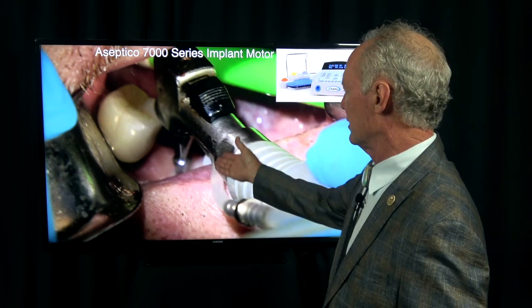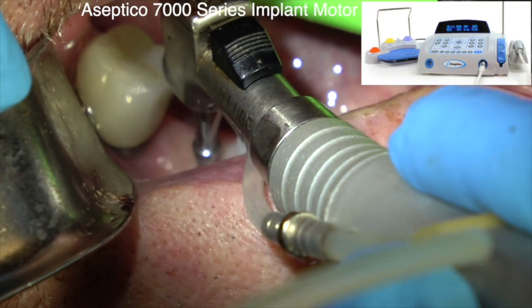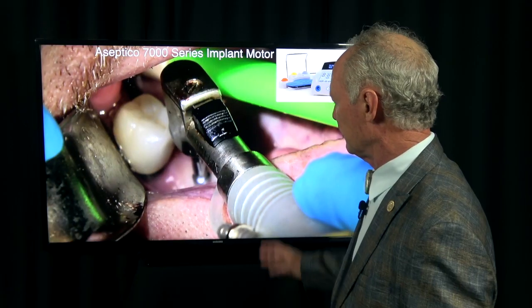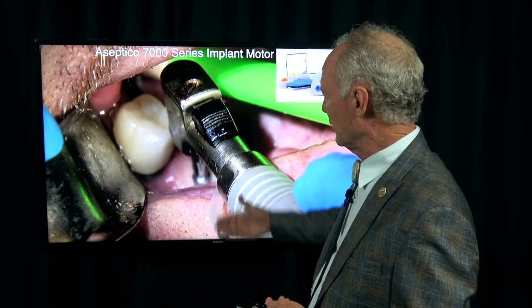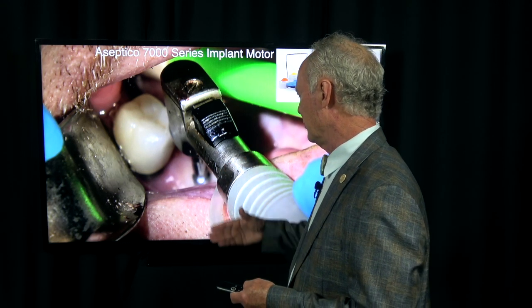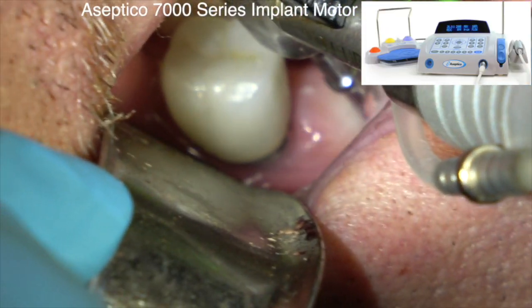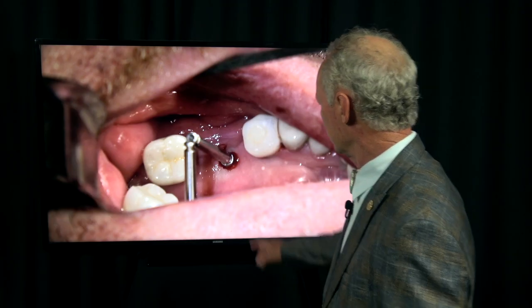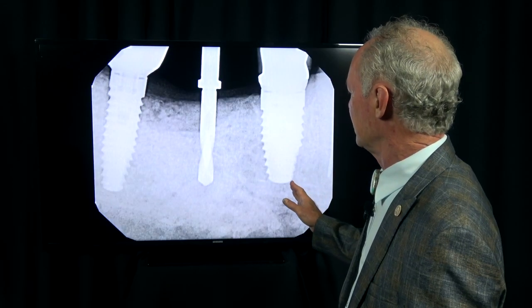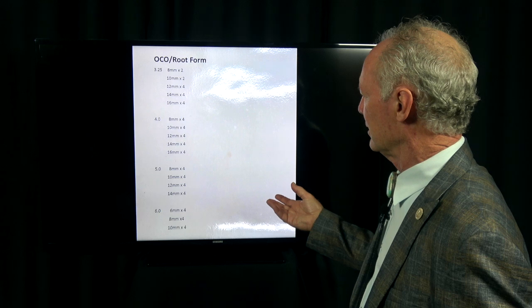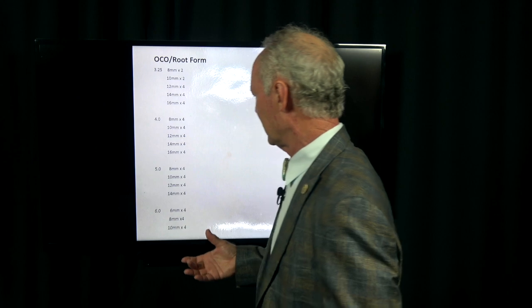If the bone is soft enough, you can start with the pilot drill with the shoulder on it, but I usually start with just a plain pilot drill. When placing the implant, you always want at least a millimeter of bone surrounding the implant. You don't want to be too deep, and you also don't want to be too far to the lingual because of the concavity on the lingual part of the mandible. I'm just slightly facial, but I've got plenty of bone on the facial — alignment is just right. I want as wide an implant as I can get without encroaching on the implants on either side, because it's about surface area — longer if thinner, or wider if shorter.